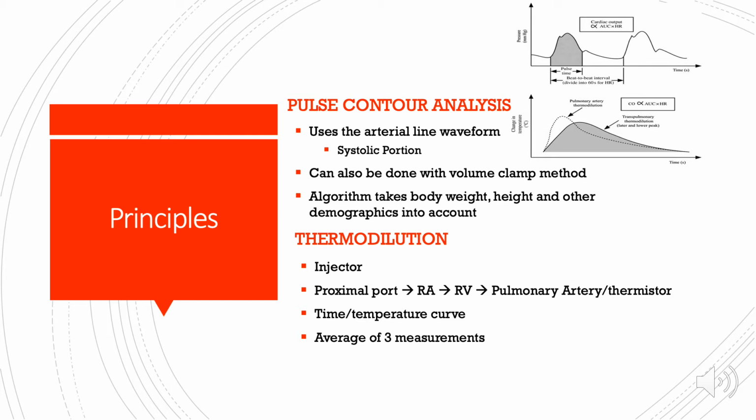This is then plotted on a time-temperature curve, and this plot is of the differences of blood temperature from start to finish.